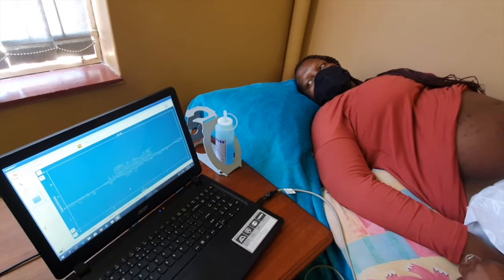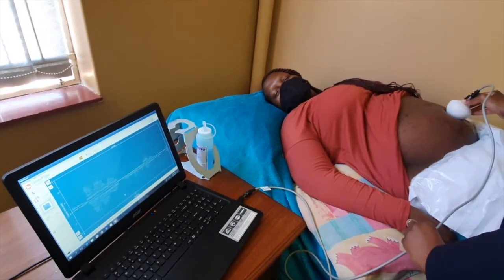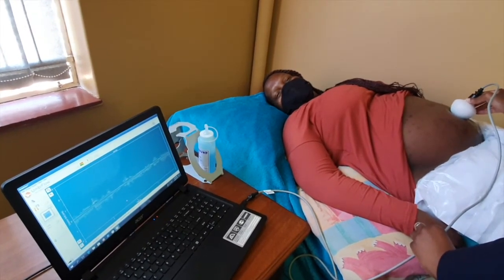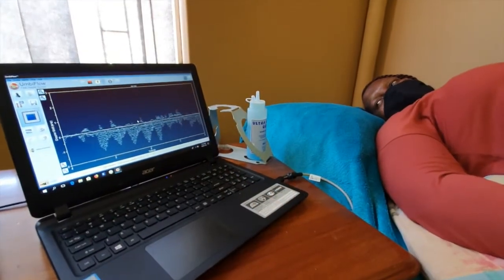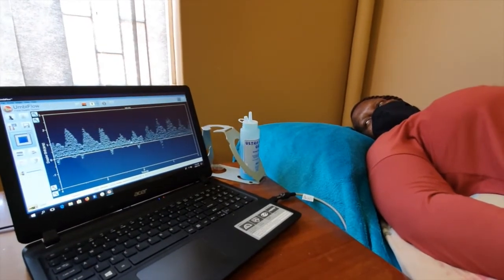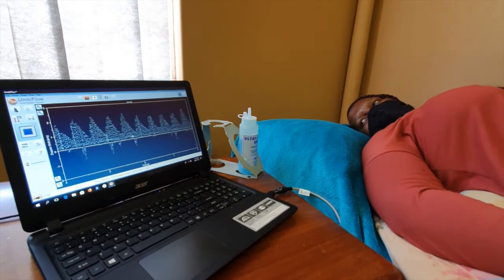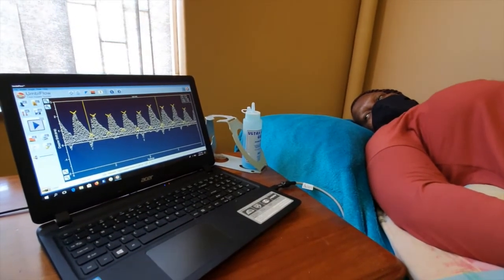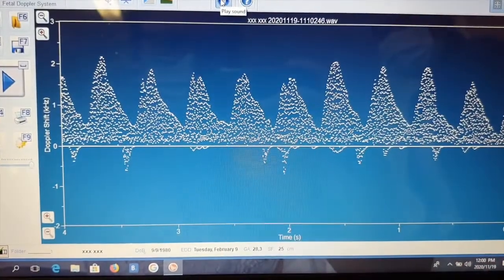Keep in mind, this is a Doppler device without the fetal imaging as in conventional ultrasound, so it can take a few minutes before a good quality waveform is obtained. Here, we are seeing good quality waves with equal amplitudes for both systolic and diastolic flow velocities. After freezing the image, the resistance indices of the umbilical artery, including the RI, PI, and SD ratio, as well as the fetal heart rate, appear in the right upper corner of the screen.